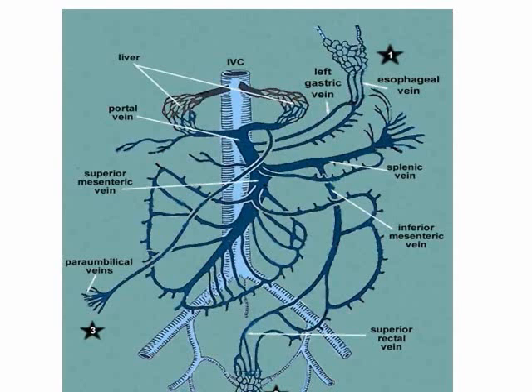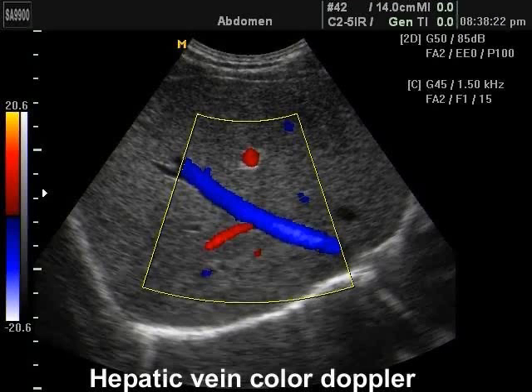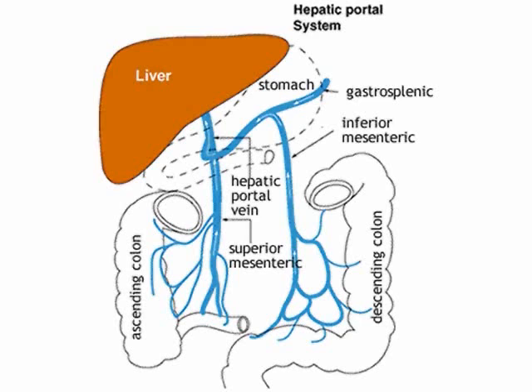This is a color Doppler of the hepatic vein. This is also a picture of the portal vein with the confluence that begins with the union of the splenic vein and the superior mesenteric vein. Note that the inferior mesenteric vein finishes in the splenic vein. All the blood of the digestive system needs to pass to be cleaned in the liver before re-entering in the IVC.